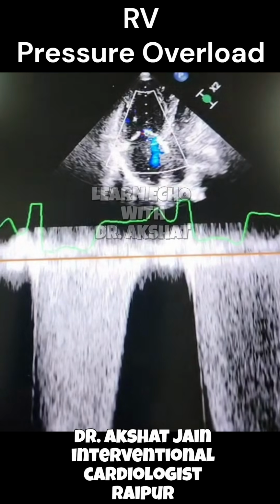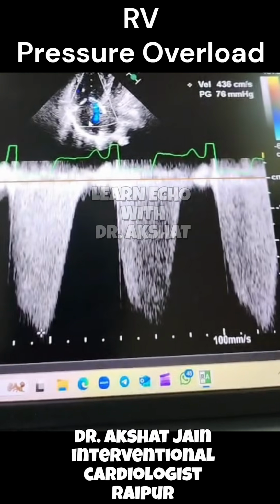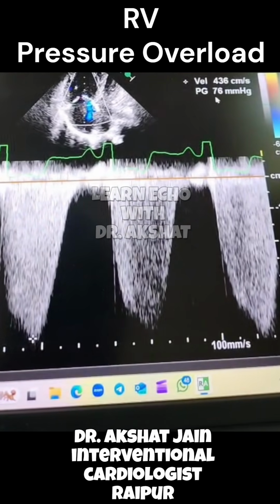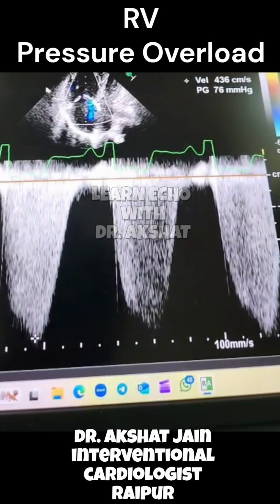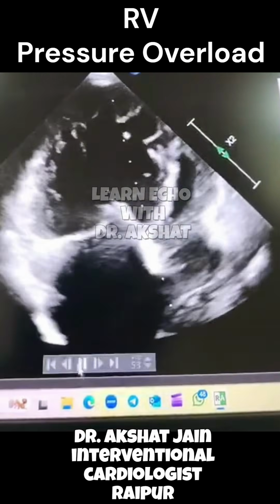I will just show how much the pressure is. So this is the PASP by TR jet in this case, and you can see that the pressure is almost 76 millimeters of mercury. So this case is a case of atrial septal defect with Eisenmenger syndrome.